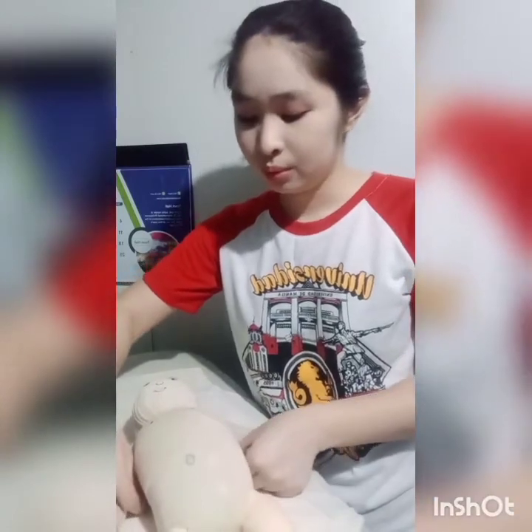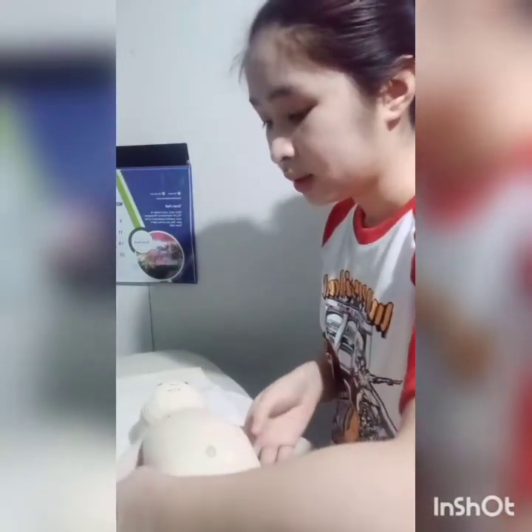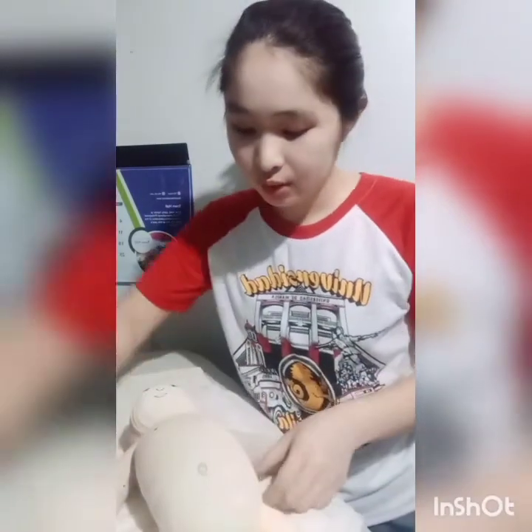Moving on, we're going to measure baby Emmy's waist circumference.